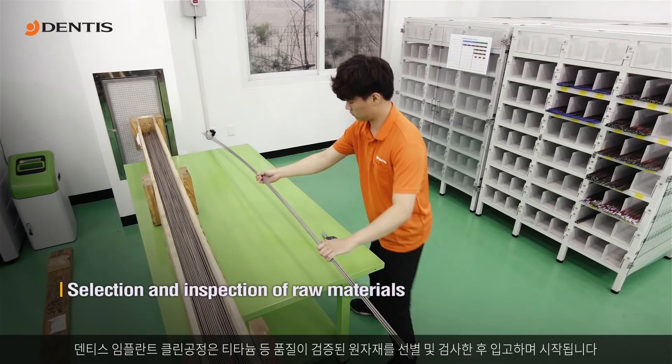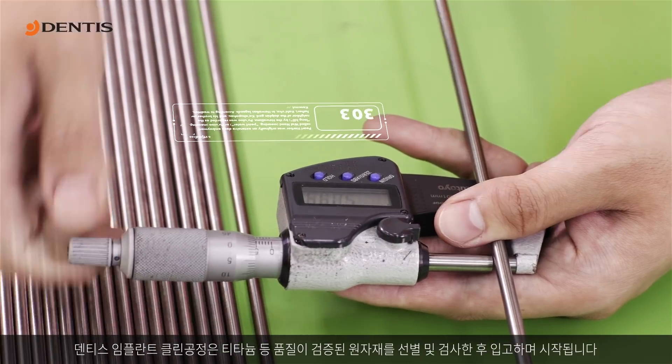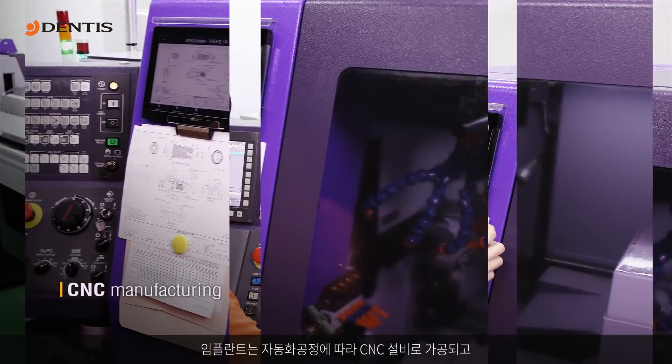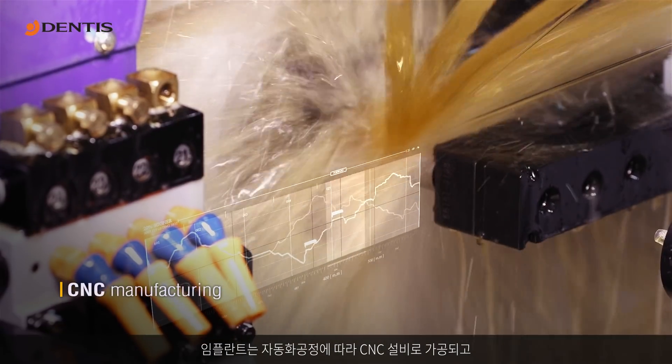The DENTIS implant clean process begins after selection and inspection of quality raw materials such as titanium. The implants are manufactured by CNC in an automated process.